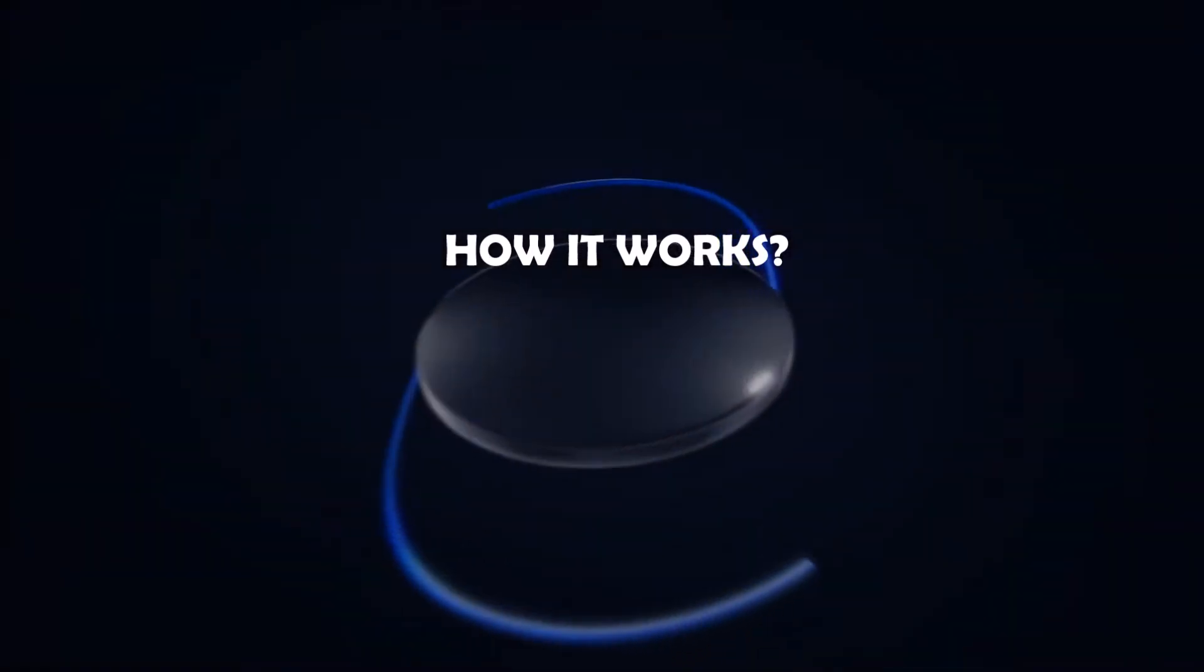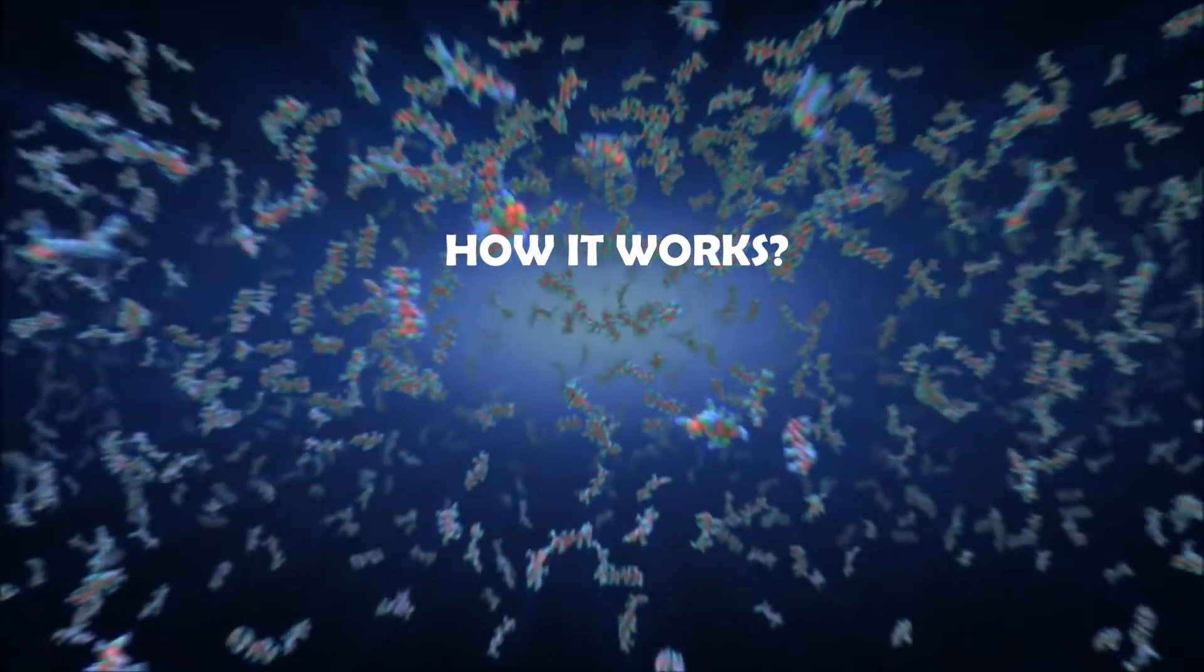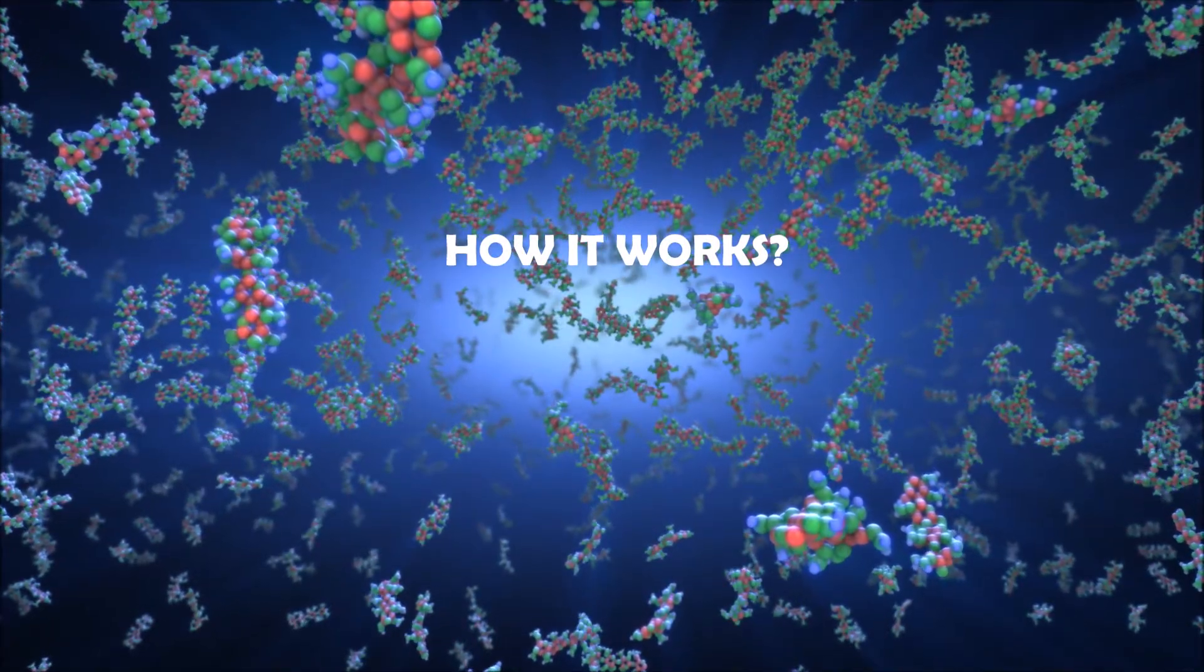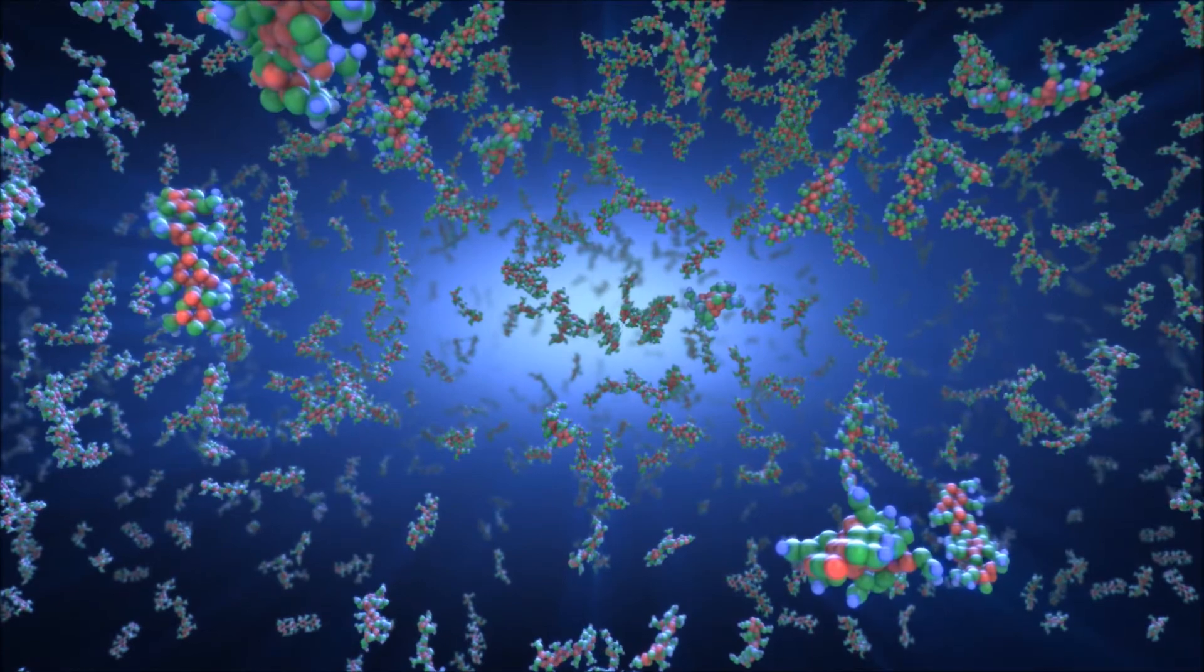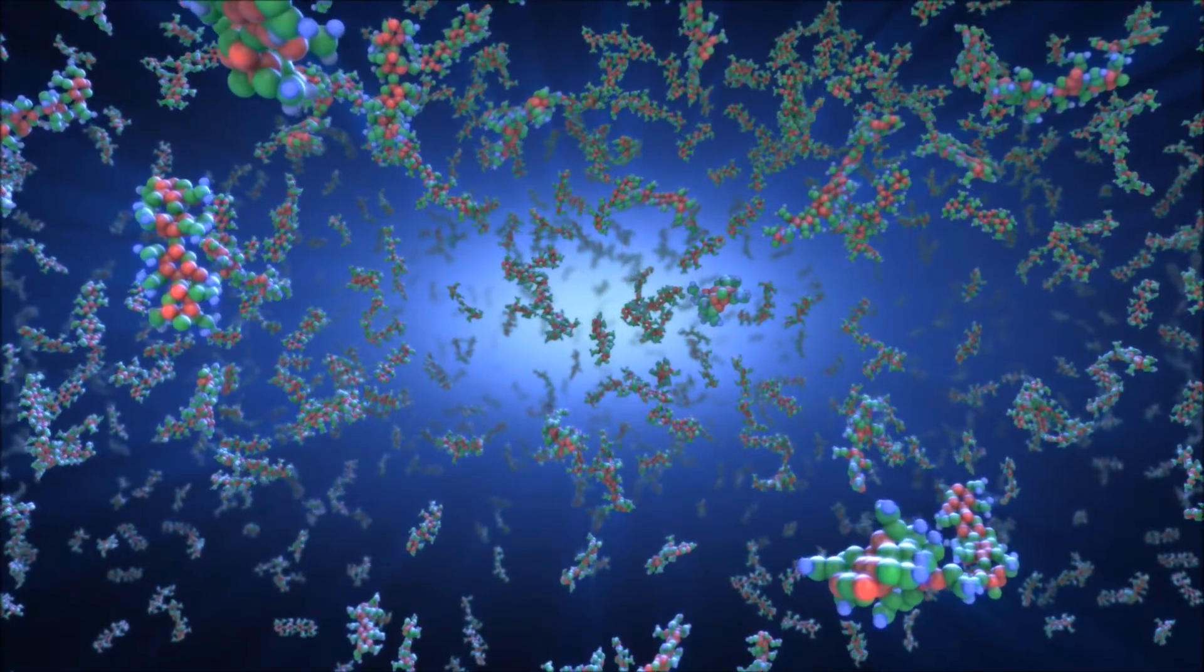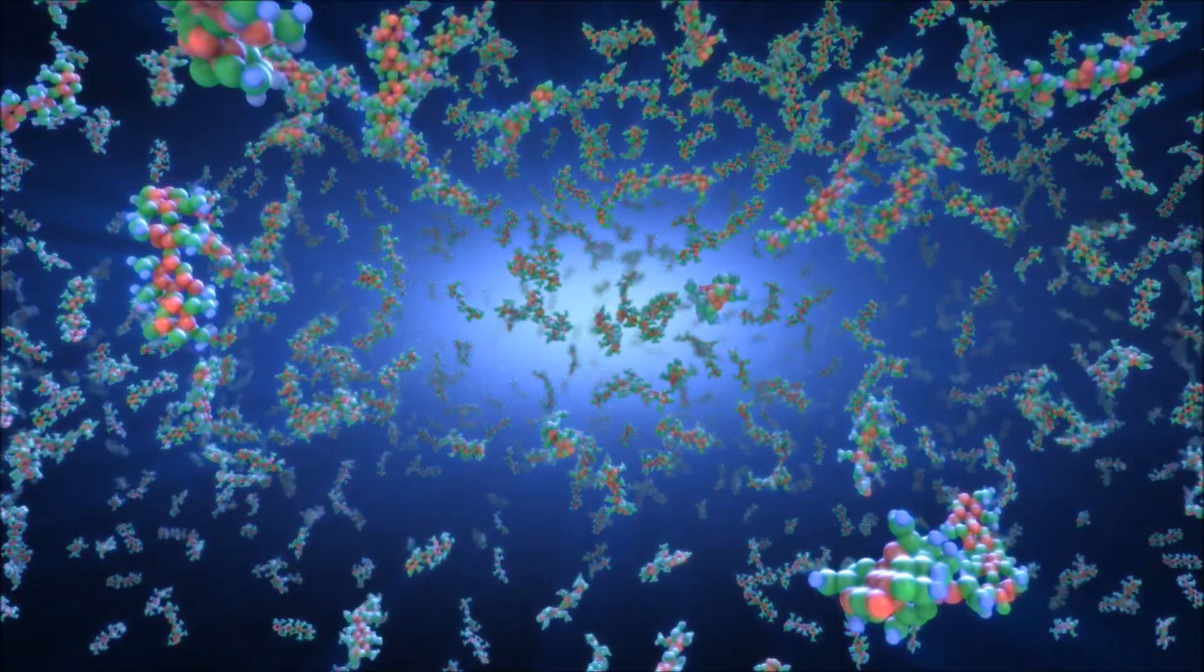Light adjustability of the lens is based on the principles of photochemistry and diffusion. RxSight's Light Adjustable Lens incorporates proprietary silicone photoreactive additives called macromers, which are distributed throughout the lens.